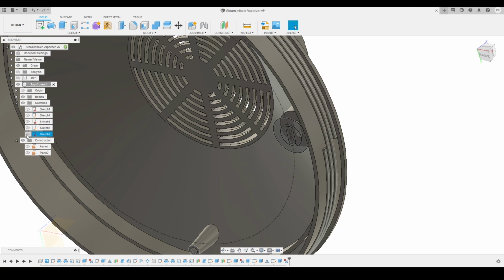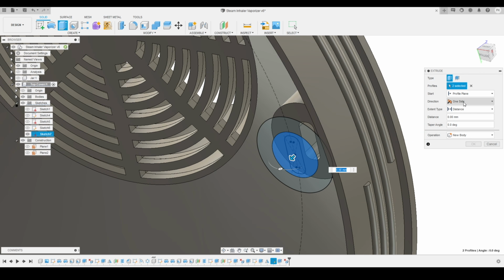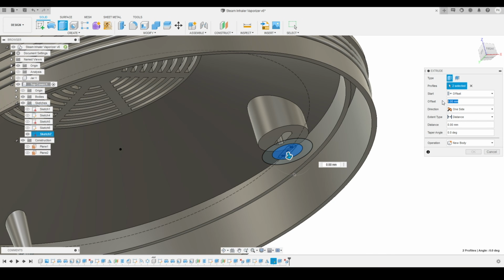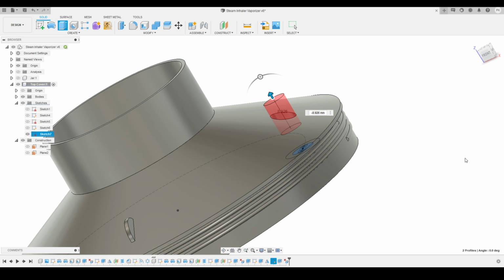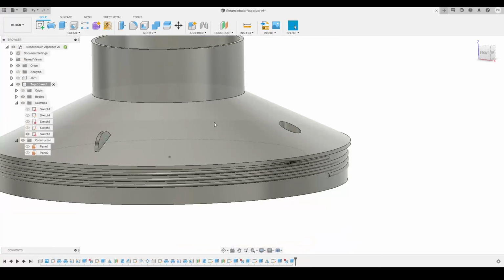And now I'm going to turn on the sketch again, and we'll select this particular profile and this complete profile, and I'm going to offset it again by maybe -5 millimeter like we did earlier, and then we'll make a cut like this. Here you can see we are making a through cut like this. So this is the kind of shape we are getting. So instead of -5, we can just increase that to -6, and then we'll press OK to set the results. So here you can see the shape we got like this.